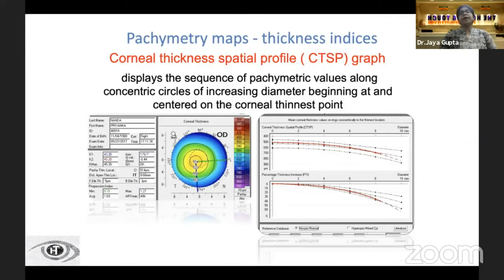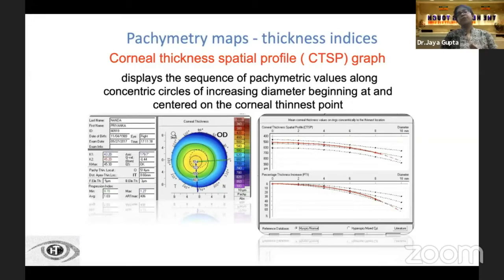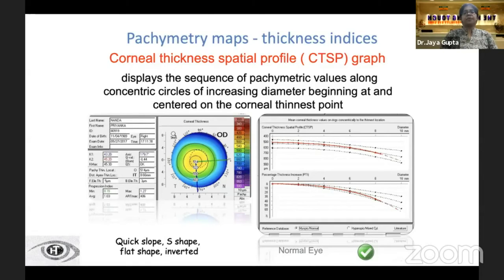In the pachymetry section, there are two graphs. The first is the corneal thickness spatial profile graph, which displays pachymetry values along concentric circles of increasing diameter beginning at the corneal thinnest point. The red curve should fall between the black dotted lines. A quick slope or S-shape is seen in forme fruste keratoconus, a flat shape in edematous corneas, and an inverted shape in PMD.